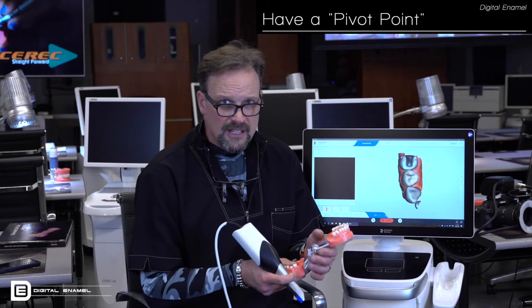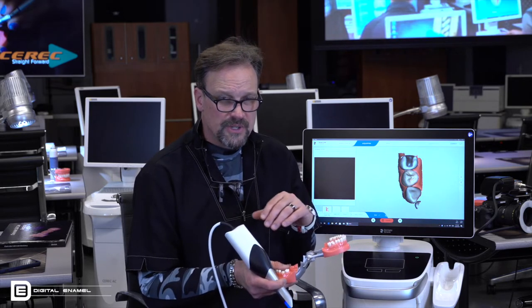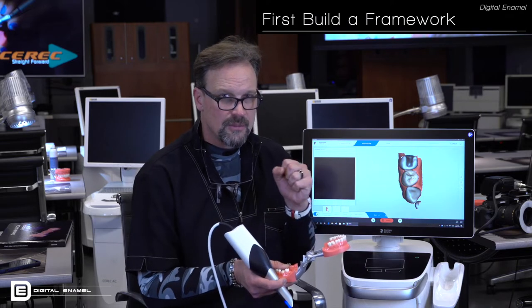Okay. Next recommendation is build a skeleton or build a framework and then go back and fill in holes. So what I mean by that is I'm gonna image the occlusal, I'm gonna image the buccal and image the lingual, and I'm gonna stop.